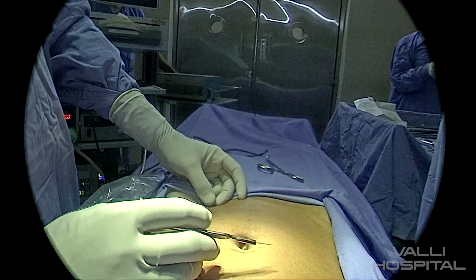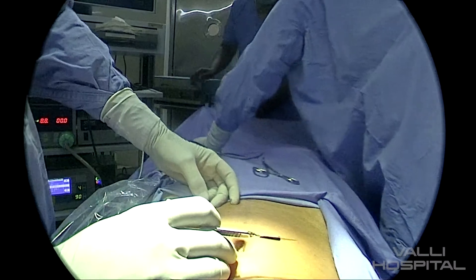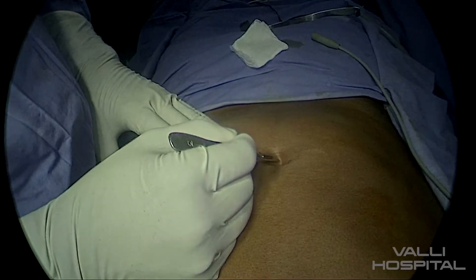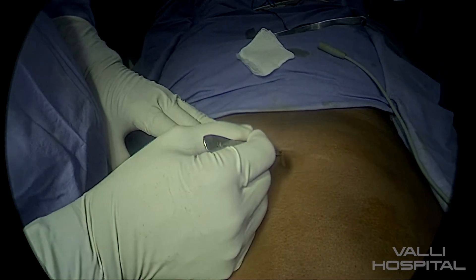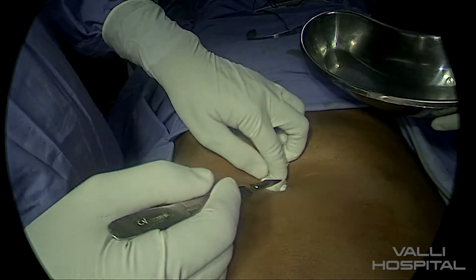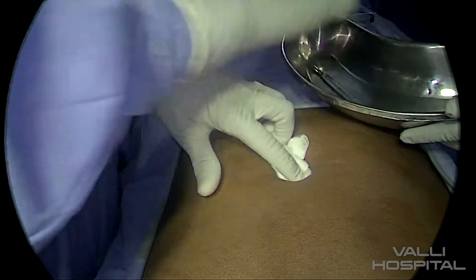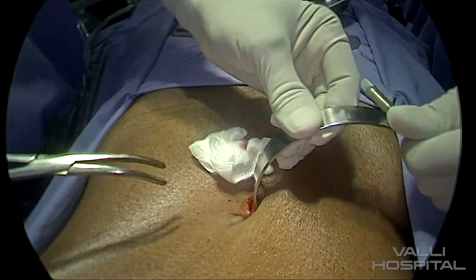The surgeon stands on the left side of the patient. The monitor will be moved to the foot end of the patient. Once the surgeon makes the port for the camera, he will be moving to the head end of the patient. The camera person will be standing to the left of the surgeon and the scrub nurse will be on the right side of the surgeon.